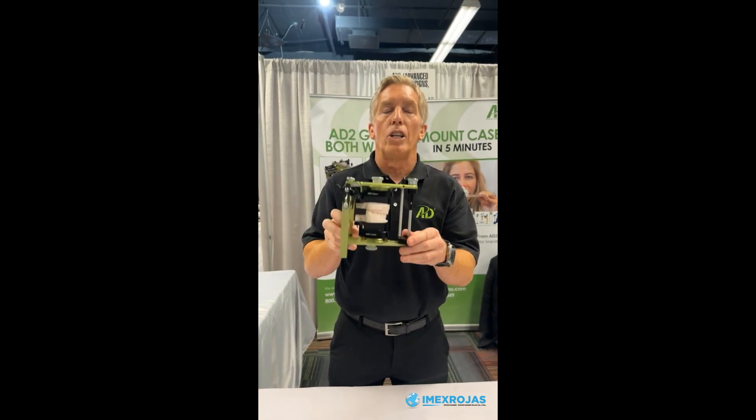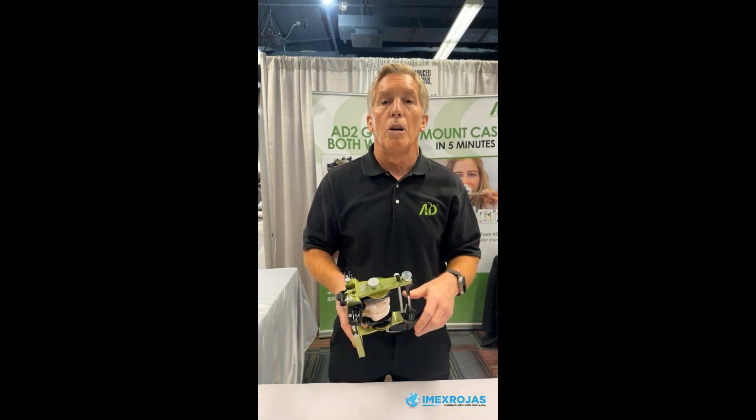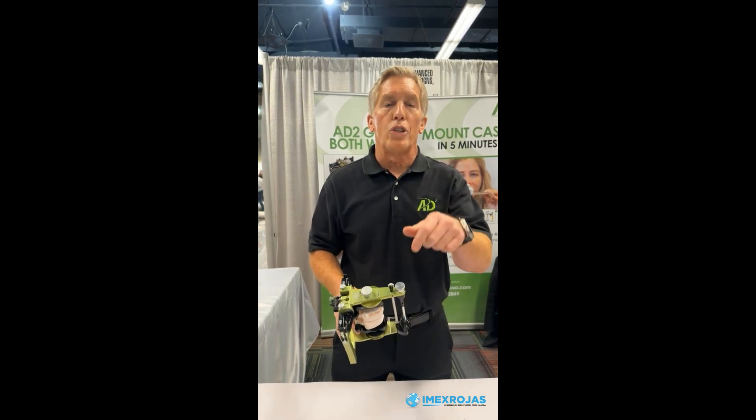These are available now for 82 articulators as well as other major brands including Stratos, Artex, and SAM, with Denar Mark 300 soon to come. Thanks for checking us out.